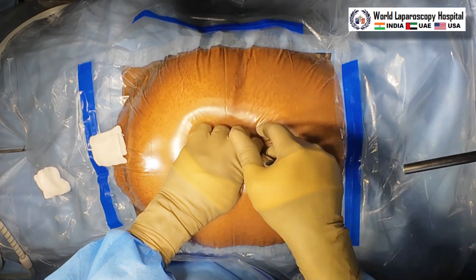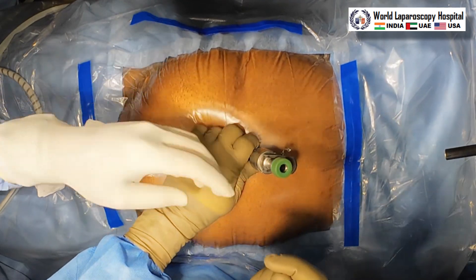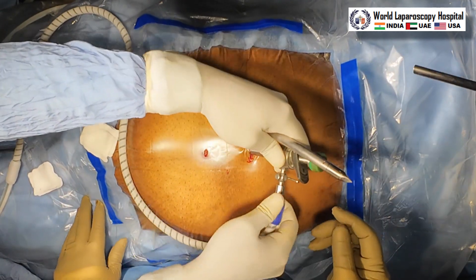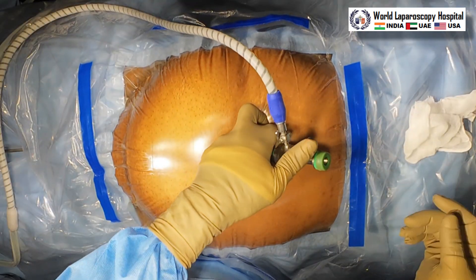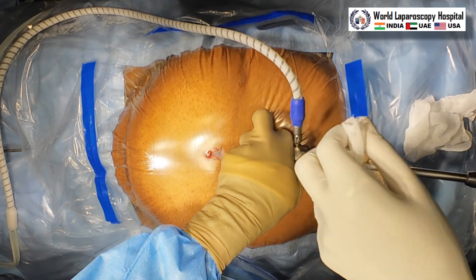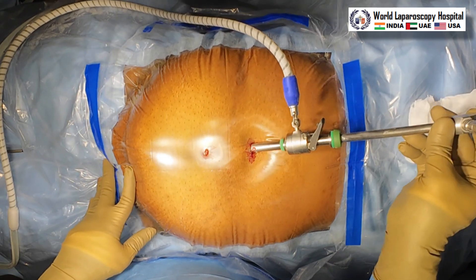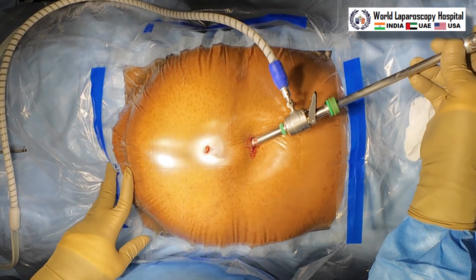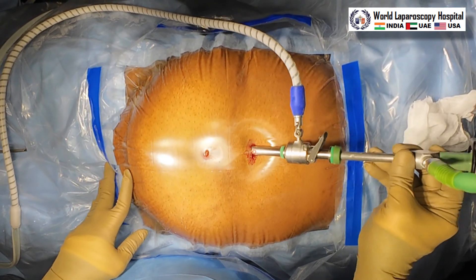You can see this is the hissing sound of the trocar, and then the trocar will be removed. After that again you will attach the tubing of the insufflator; here the maximum flow rate will be increased to 10 liters per minute. Now the telescope is introduced, and we will have the initial assessment of the anatomy and initial diagnostic laparoscopy. After that we will put the secondary port according to the baseball diamond concept.